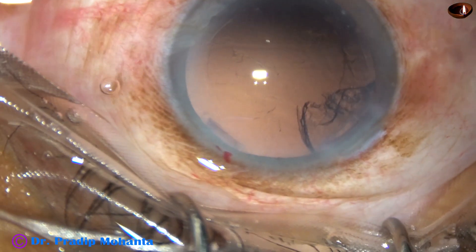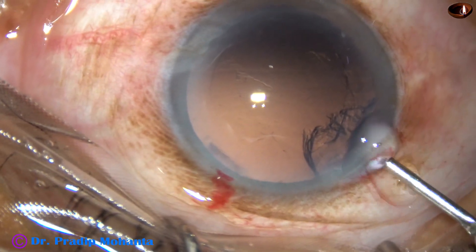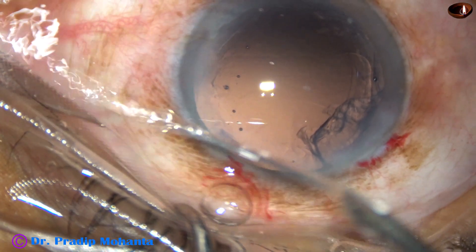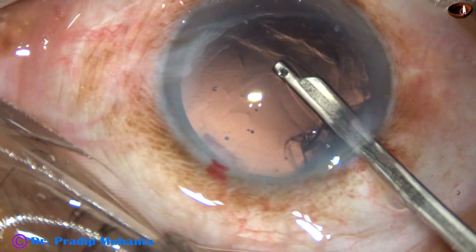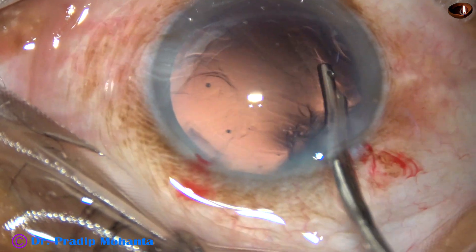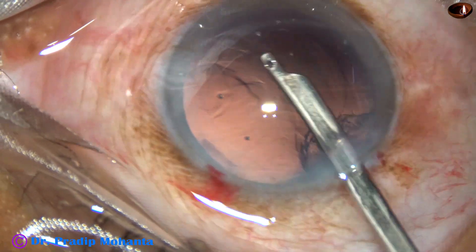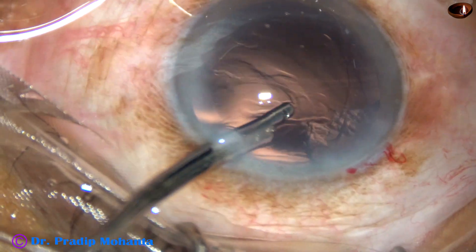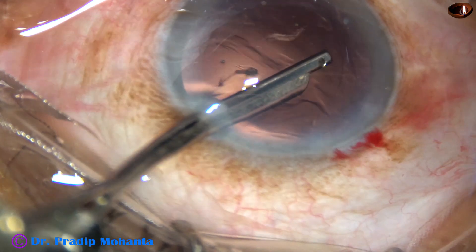Now visco is injected into the anterior chamber, and then a 23-gauge Simcoe cannula is used to remove the remaining cortical matter. There are some cells at around 8 o'clock — it is being removed. Some fibers take a lot of time to come out. Now the sub-incisional cortex is removed.